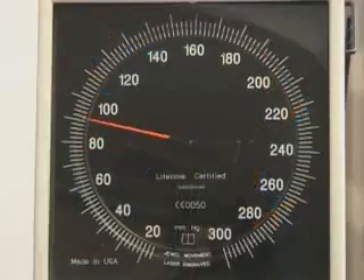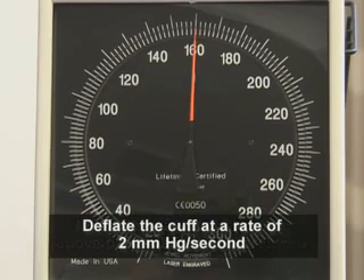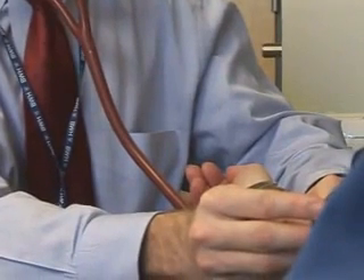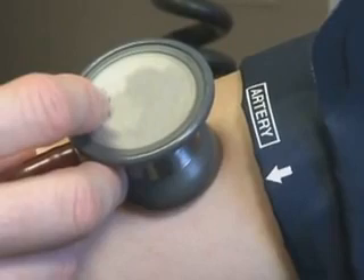Inflate the cuff to a level 20 to 30 mmHg above the pulse obliteration pressure. Then deflate the cuff at a rate of approximately 2 mmHg per second while listening for sounds. As the pressure in the cuff is decreased, blood flow in the brachial artery increases, creating turbulence, which generates Korotkoff sounds.